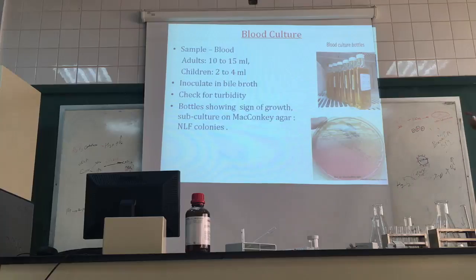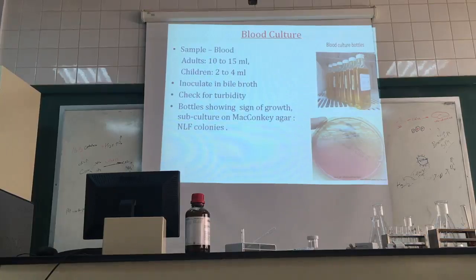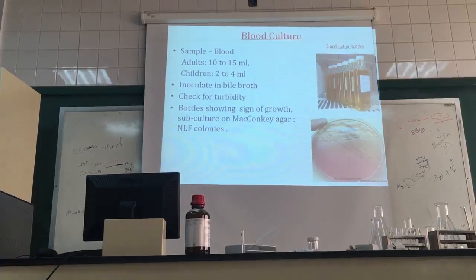Usually what we do is first use the culture bottles. From the patient sample, for example, you withdraw blood from the patient, bring it to the laboratory, and put the blood sample into these bottles. This is the incubator, and you put these bottles here for a night, 24 hours. But in the case of Salmonella, sometimes it may take 2 days, sometimes 3 days. And when you see the culture bottle after 2 or 3 days, if it is clear, same as it was the first day, there is no infection.